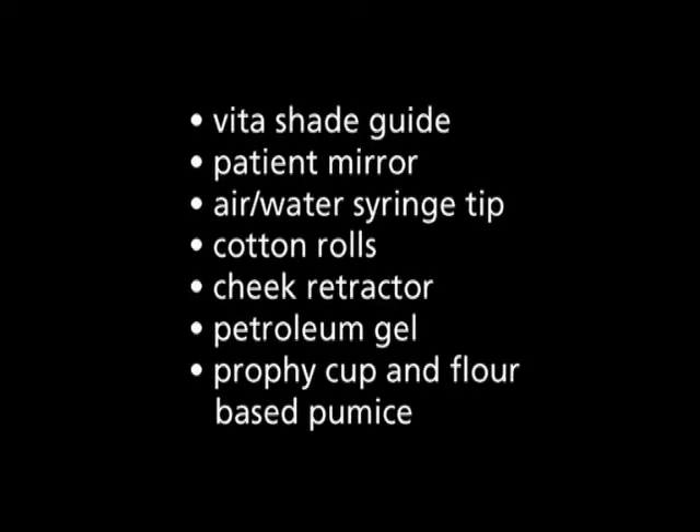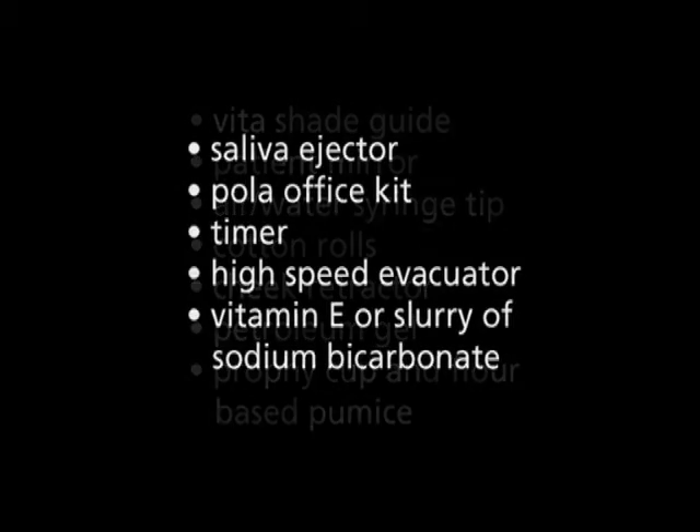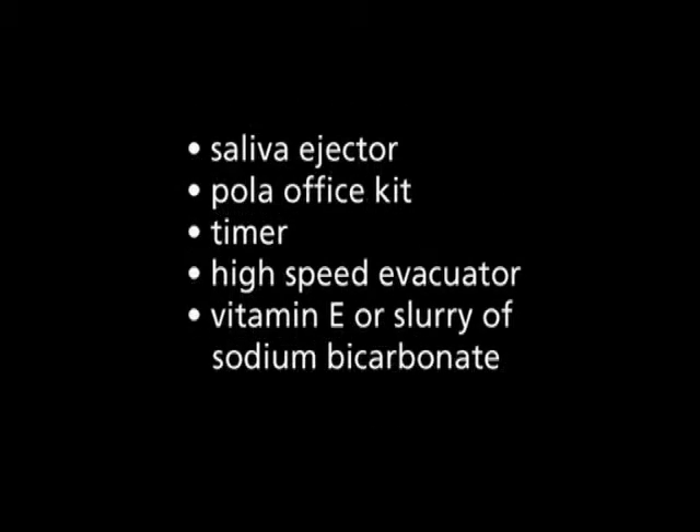Assemble all of the material you will need for the whitening procedure including: Vita Shade Guide, patient mirror, air water syringe tip, cotton rolls, cheek retractor, petroleum gel, prophy cup and flour based pumice, saliva ejector, Pola Office kit, timer, high speed evacuator, and vitamin E or slurry of sodium bicarbonate.